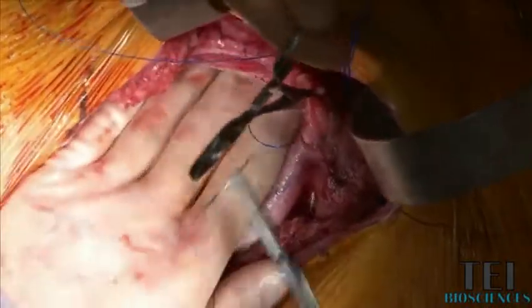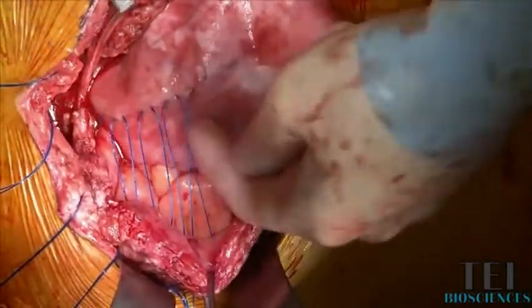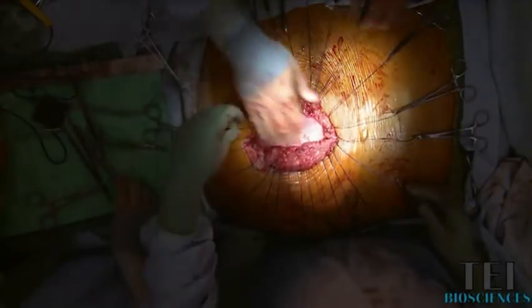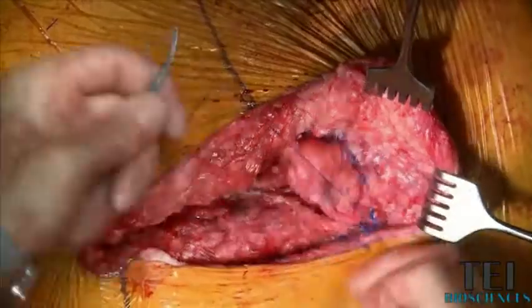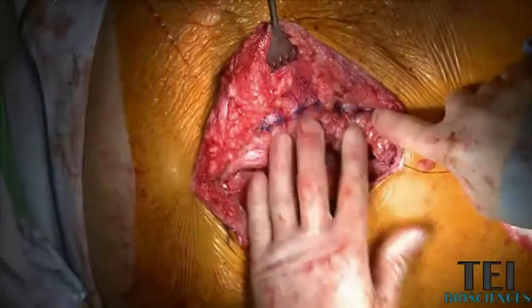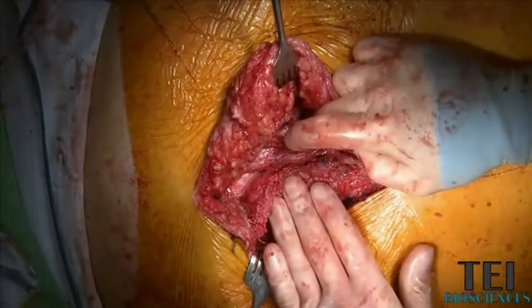That's why I trim off that excess part laterally. We're just marching down and you just want to check that you're lining things up properly every once in a while. You'll notice that my spacing of these stitches is relatively even — you don't want any bowel to be able to get in between any of these. When we tie these, we'll make sure there aren't any spaces. What you should see is a relatively regular line of sutures coming through the fascia, and in between you can see that the mesh has been inlaid, nice and tense, and the fascia closes easily over the top and kisses.